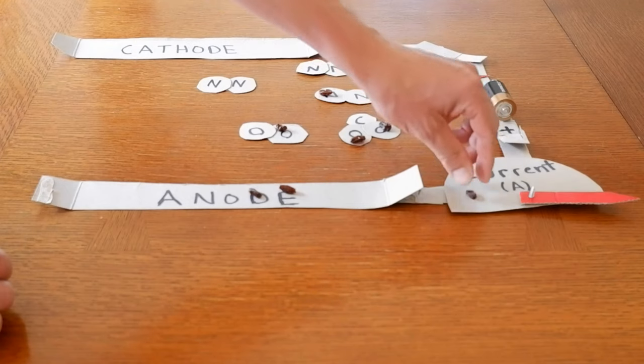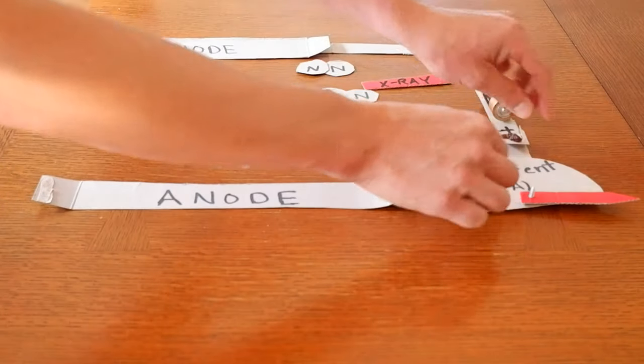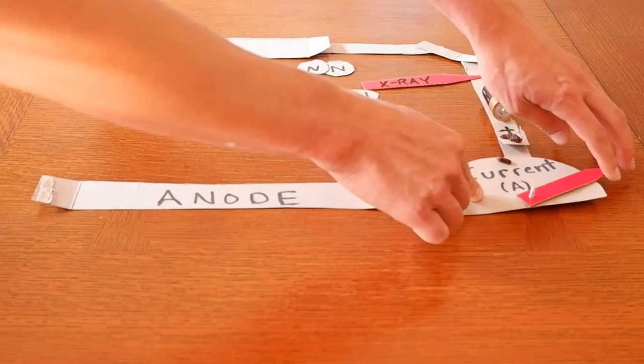They want to go to the positive, they're going to pass through this current meter, and we're going to go from a zero current to a non-zero current.